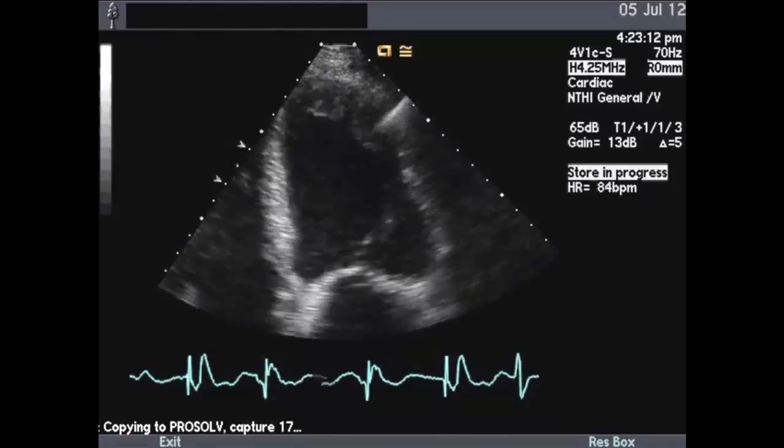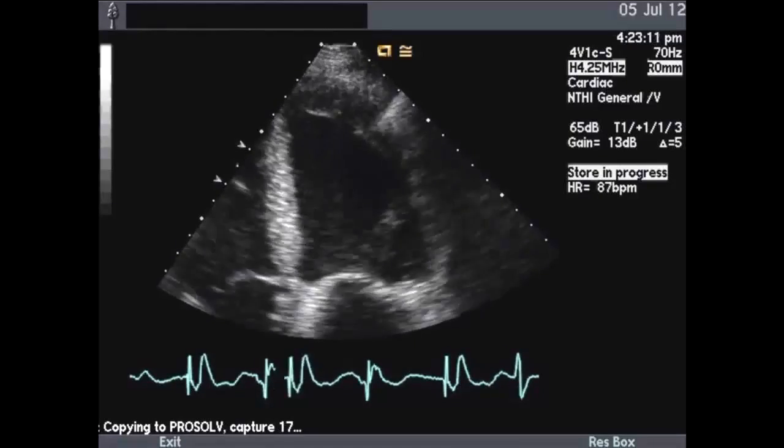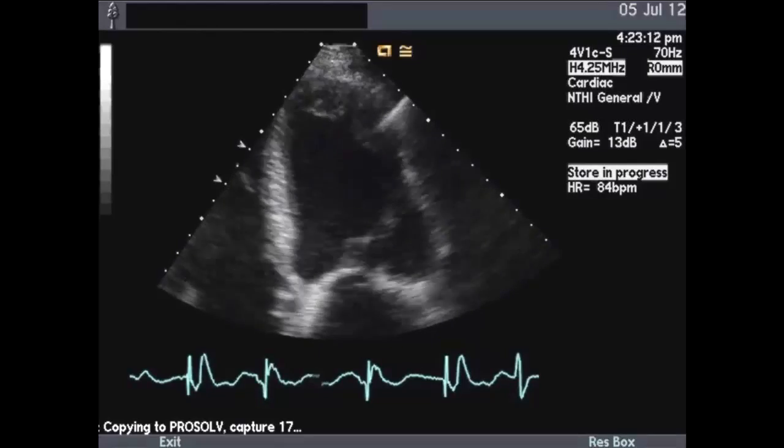So do the images answer the question, apical thrombus? Keep it in your mind, would you use it, or jot it down? Because I am going to show you 3, and then I'm going to show you the contrast images. So this is case number 1.